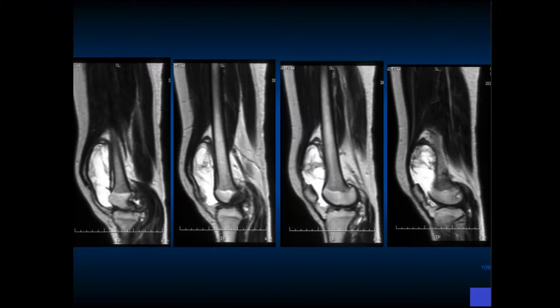This is her MRI scan, a pretty significant MRI scan. Look at the suprapatellar effusion. This shows how high up the suprapatellar pouch goes, almost a third of the way proximal on her thigh, her femur. Epiphyseal plates are closing, but there is diffuse swelling everywhere, swelling posteriorly, swelling up here in the distal femur posteriorly. And the classic appearance of this is pigmented villonodular synovitis. So the synovium has fronds and is abnormal. And her diagnosis, we felt, was PVNS.